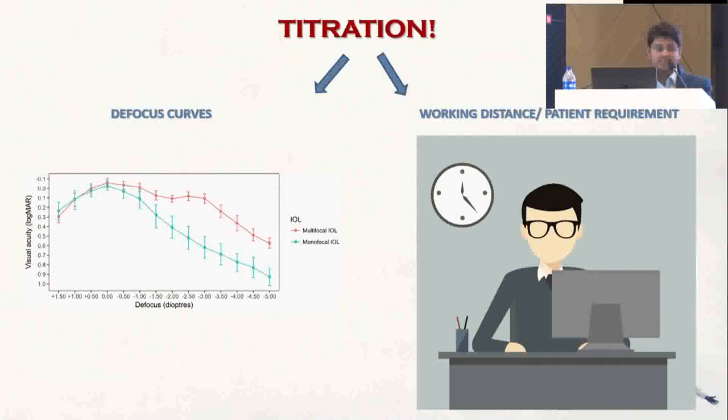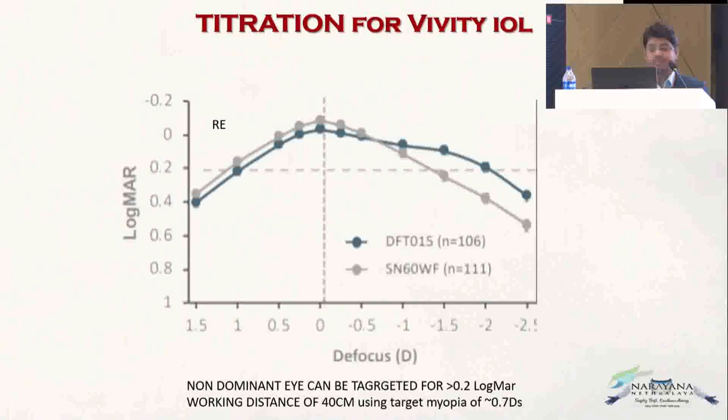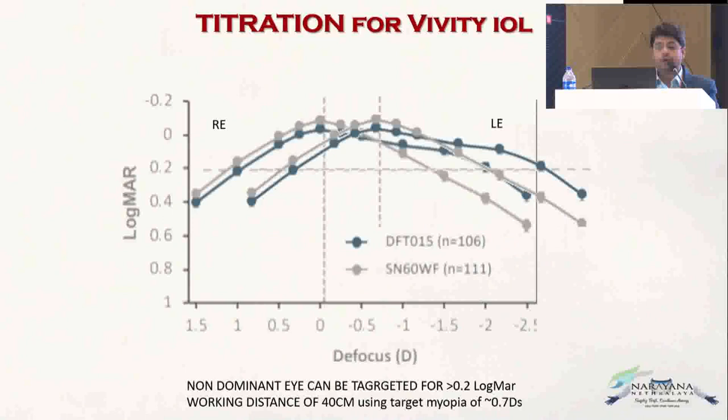Titrating the EDOF depends upon two things: what working distance the patient wants, and the defocus curves of the respective lenses. So when you're titrating for, say, a Vivity IOL in the non-dominant eye, considering that 0.2 logMAR is where vision is good enough, based on the FDA approval defocus curves, for a working distance of 40 centimeters, the target myopia should be 0.7 diopters sphere because the Vivity provides an additional depth of focus of up to 1.5 diopters. So based on the defocus curves, you have to titrate which EDOF lens to implant in the patient.